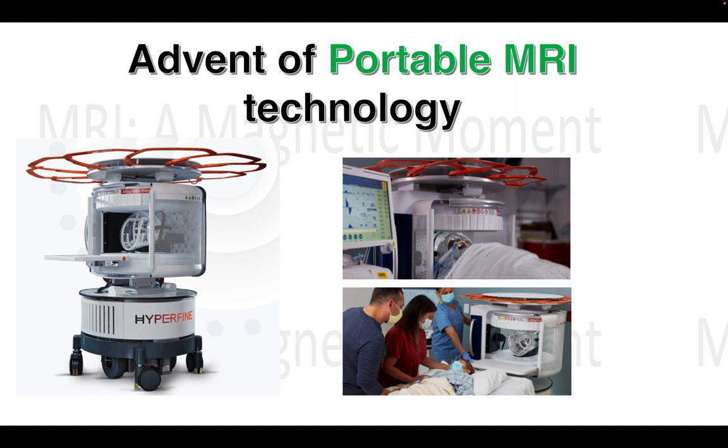So this portable MRI system drives directly to a patient's bedside. From what I understand, I haven't seen it yet in person, and from what I read about it, it plugs into a standard electrical outlet and is controlled by an Apple iPad.